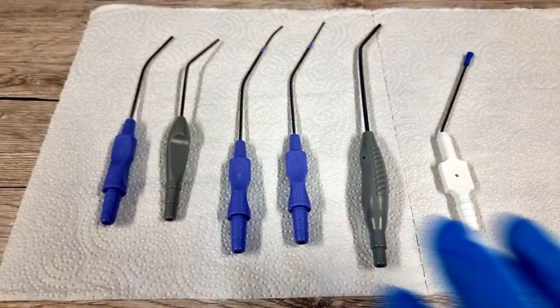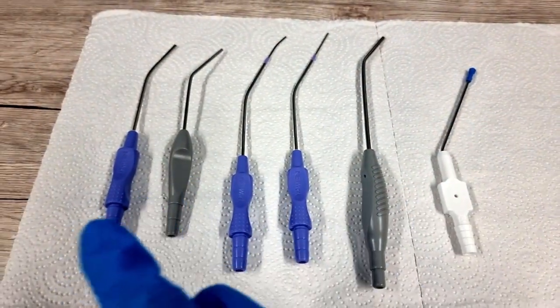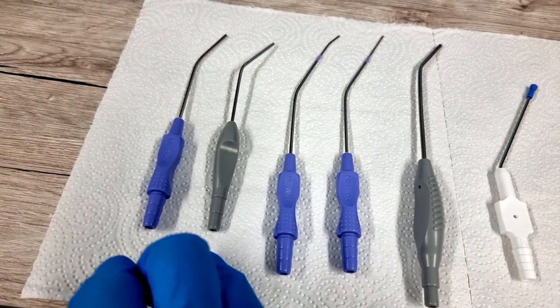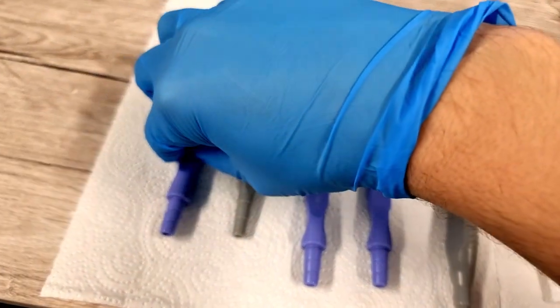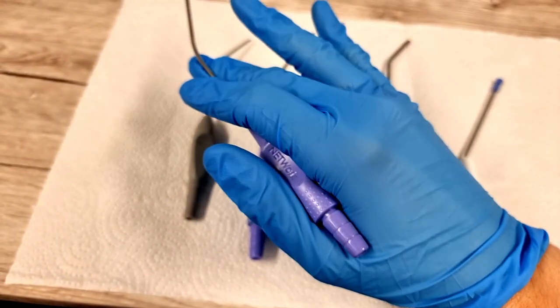All right, so these are the suction probes that we use during ear procedures. I've ranked them in how frequently I use them. Over here, you will have seen these before. These are Zollner or Zoellner suction probes. This is the one that I use most commonly. It's made by Network, and it just feels very comfortable in my hand.